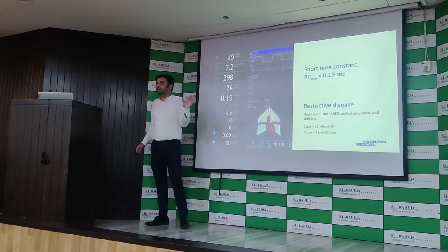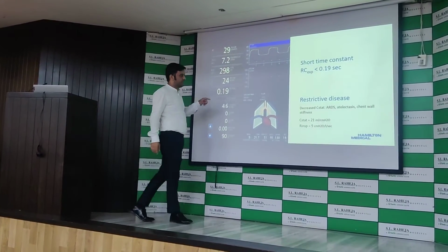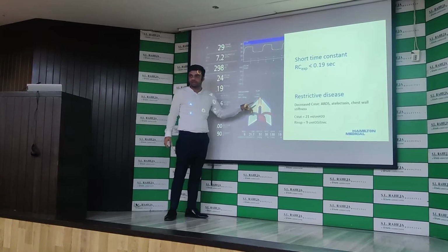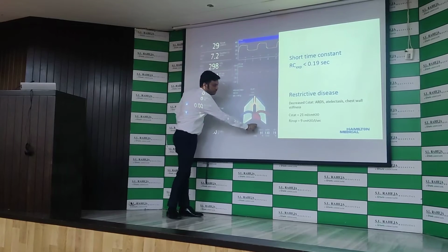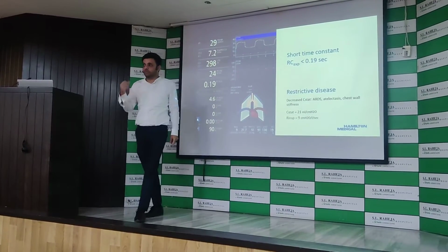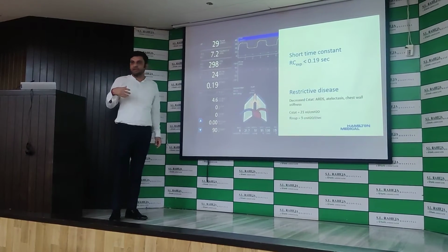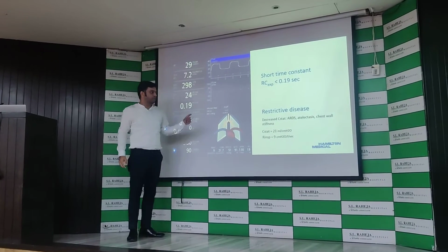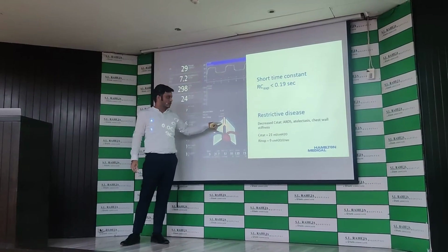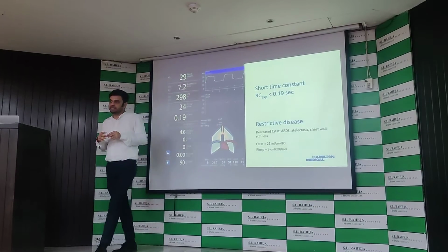Here we have again a different tool for monitoring, which is called dynamic lung. In the dynamic lung we see the airways for the inspiratory resistance, and for the patient effort we see the diaphragm coming in. So we are able to see that on the monitor. When the patient takes an inspiratory effort, we'll see the diaphragm coming in, blinking. Similarly, for any sort of obstruction, you will see red marking lines inside, which shows that there is an increased resistance.